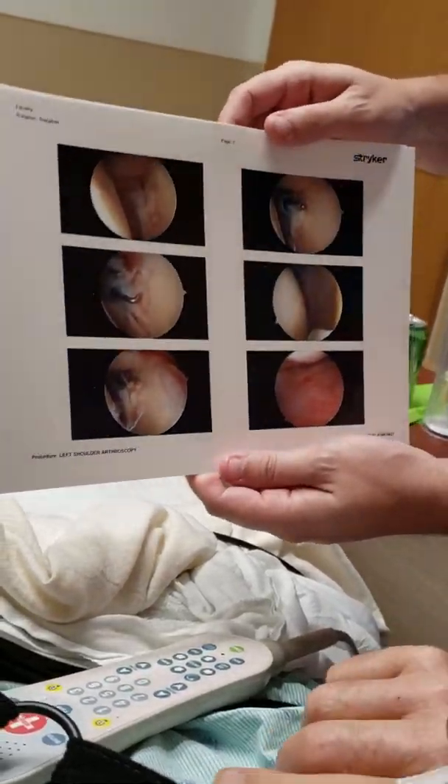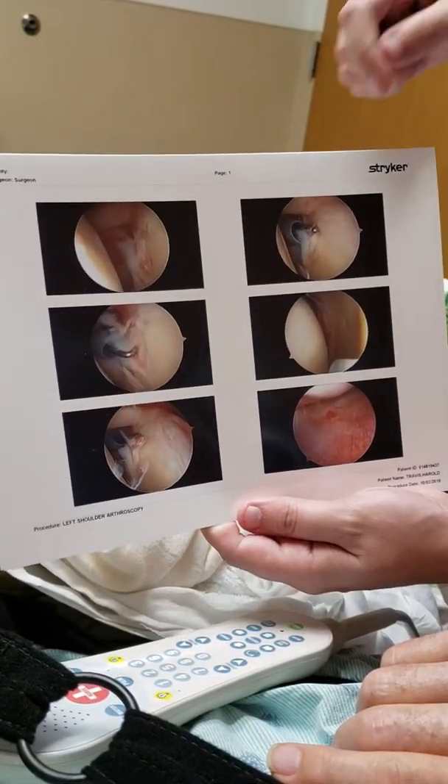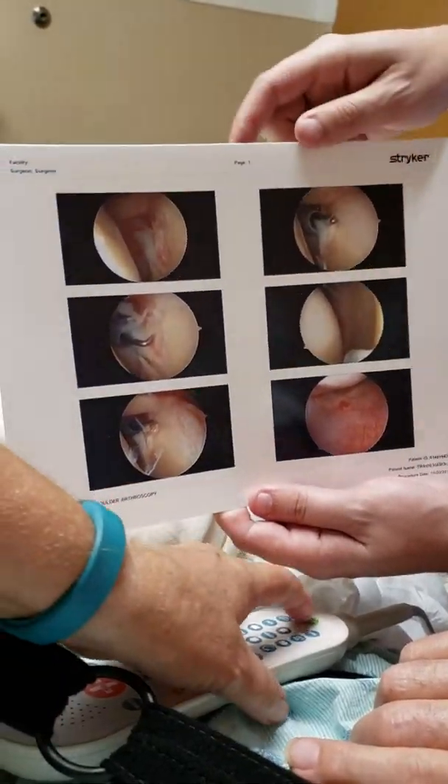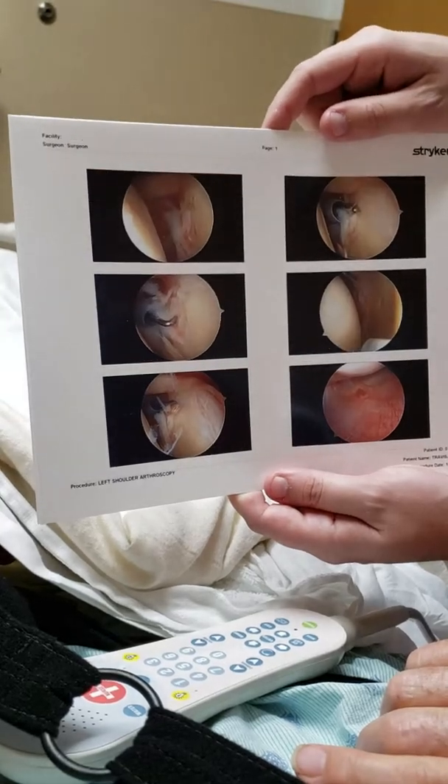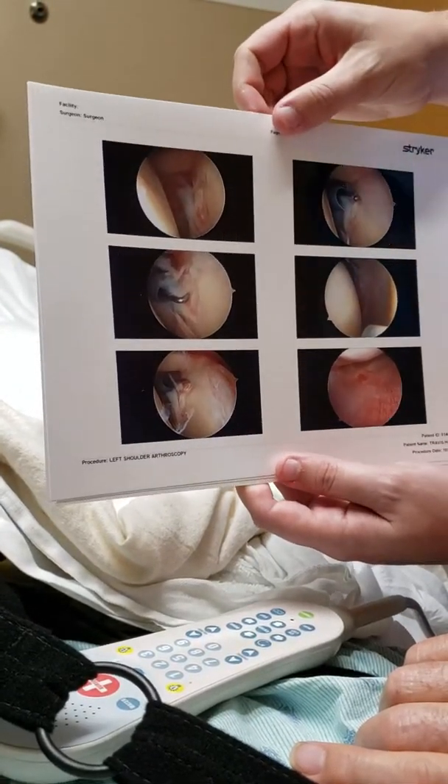It got down pretty low. Here's a shaver — it's a motor shaver in there getting rid of some of that labrum tissue. That tear can cause pain if it gets pinched, so we get rid of the edges to clean that up.